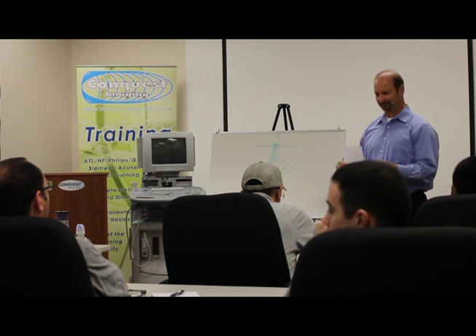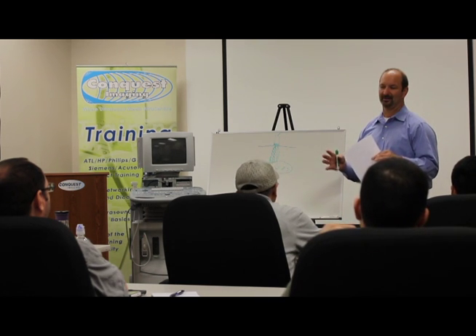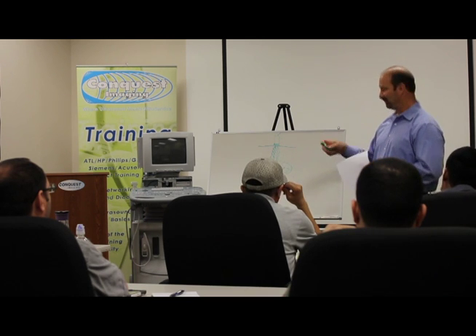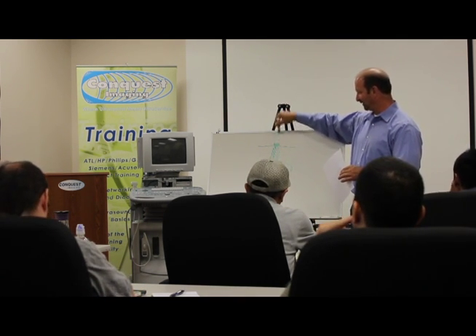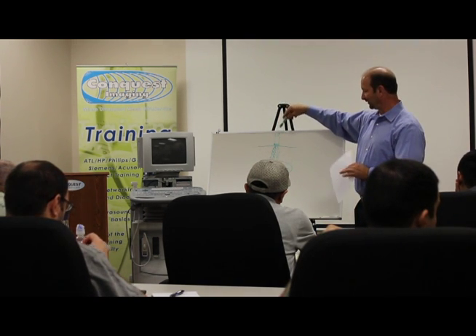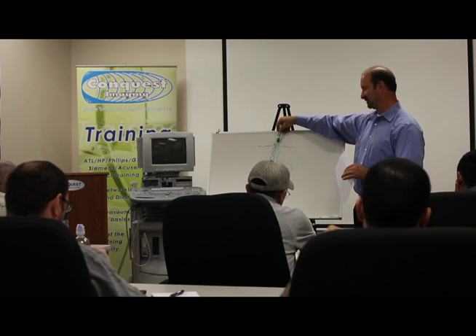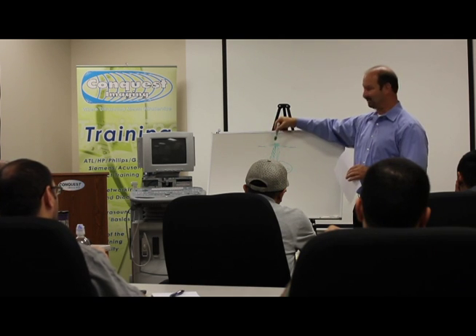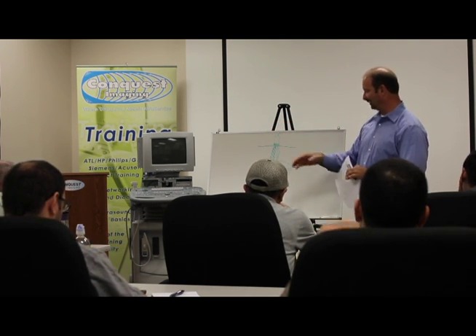That's why, from your standpoint, the machine has to be put together so that there's no outside interference and noise, because otherwise the machine is going to clutter up the image with excess noise coming from inside the electronics. It's just an electrical current that comes down that cord, plain and simple, that excites these transducers. It's most basic, and that's how you put together your image. So that's what it does.